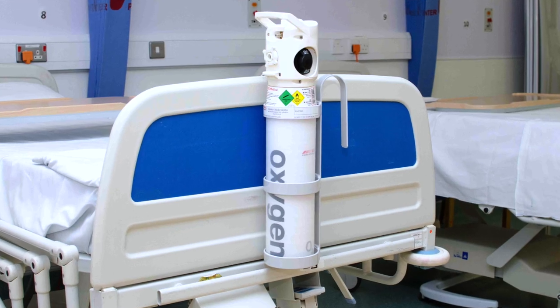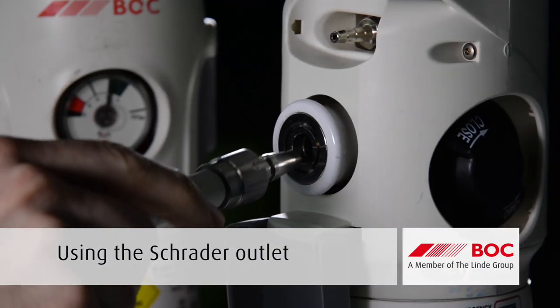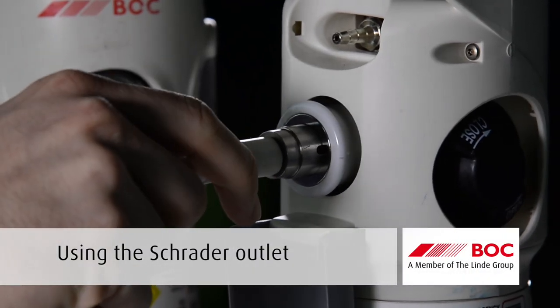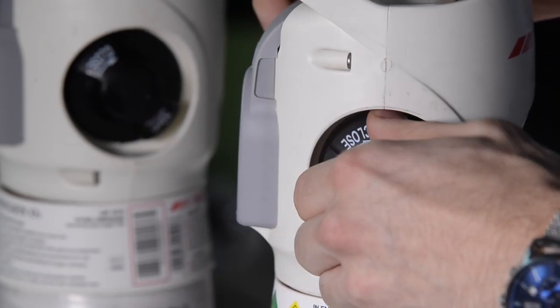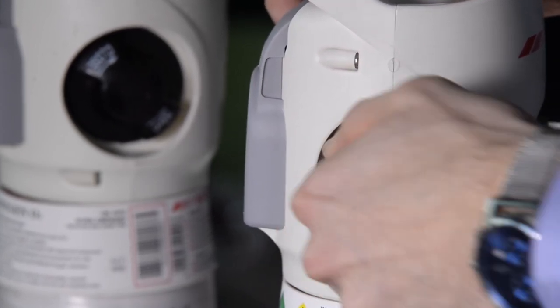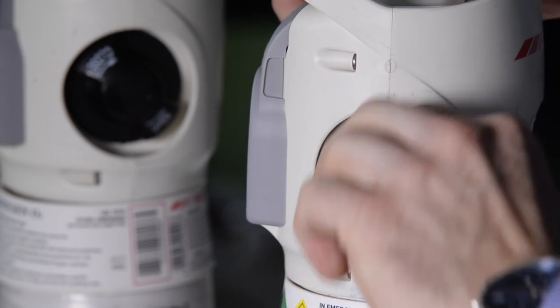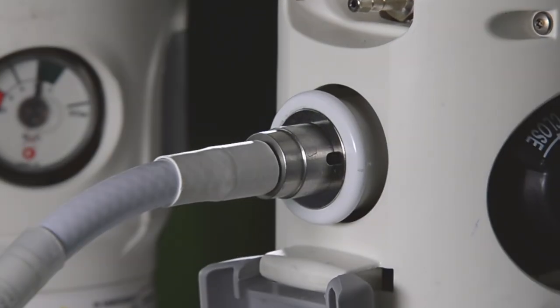Use a suitable cylinder holder where possible. Insert the oxygen probe into the Schrader outlet, ensuring the probe clicks securely into place. Slowly turn on the cylinder by rotating the hand wheel anti-clockwise until it comes to a stop. Check for leaks, which may be indicated by a hissing sound.